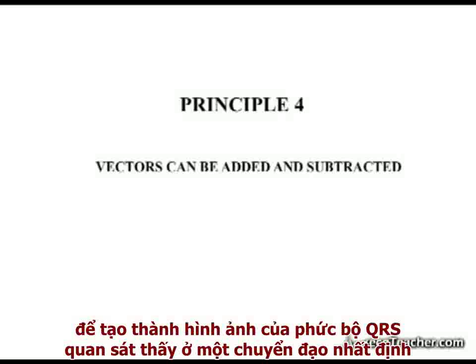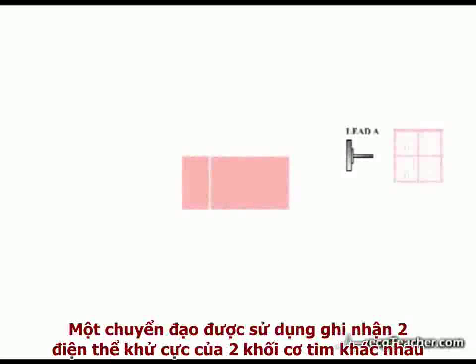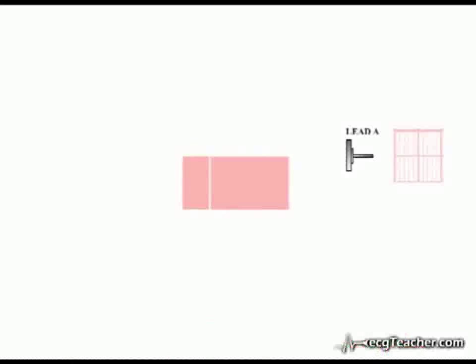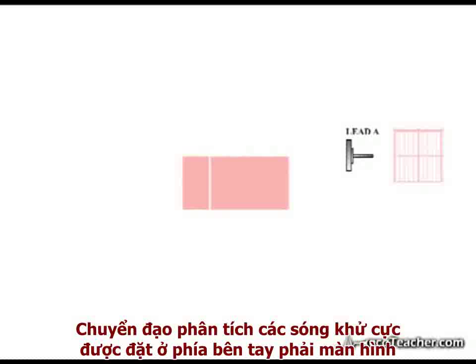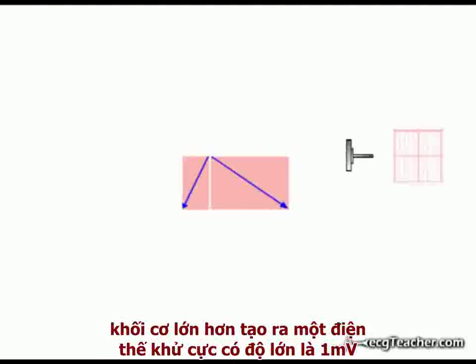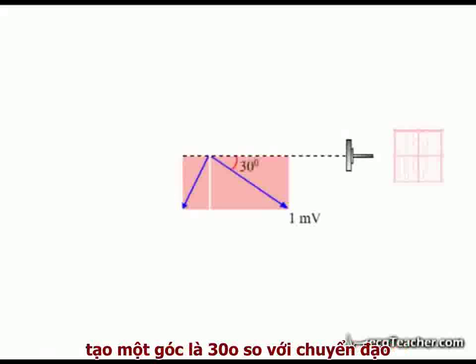a given lead. In the simple model shown here, an ECG lead is facing two pieces of ventricular myocardium of different mass and differing patterns of depolarization. The lead analyzes depolarization in the plane of the screen. The two pieces of myocardium depolarize at exactly the same time. The mass of muscle in the larger section is sufficient to generate a voltage of 1 millivolt, and it is traveling through the muscle in the plane of the screen at an angle of 30 degrees off the direct line to the lead.